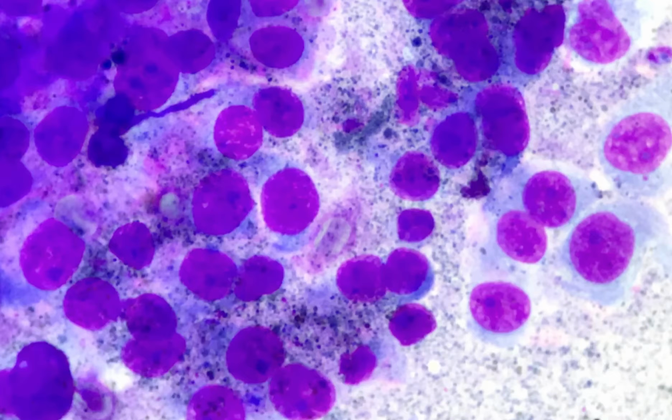And malignant melanomas commonly occur in the nail bed area, in the lip, and mucocutaneous junctions. When you see a melanoma in these regions, they are going to be highly malignant and they carry poor prognosis.